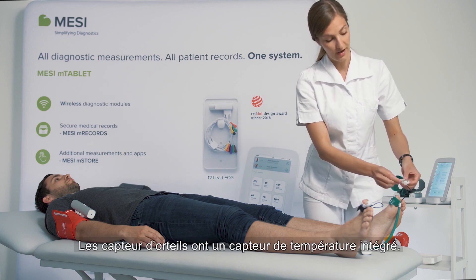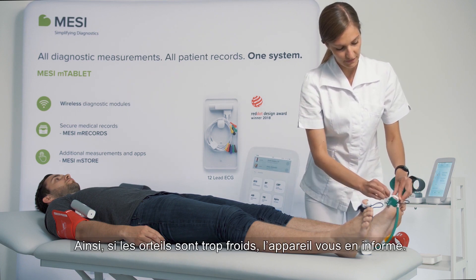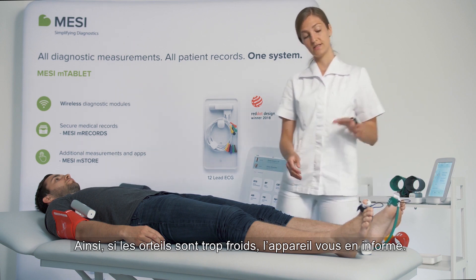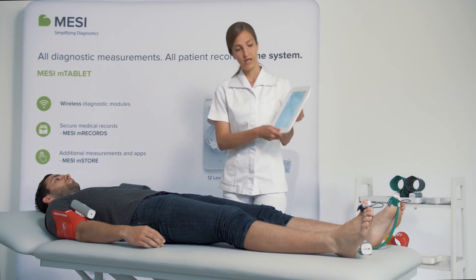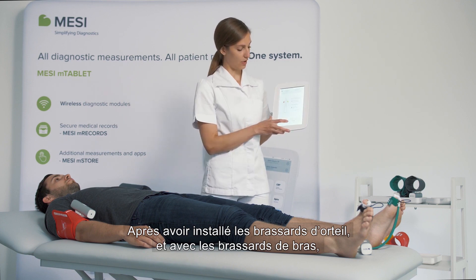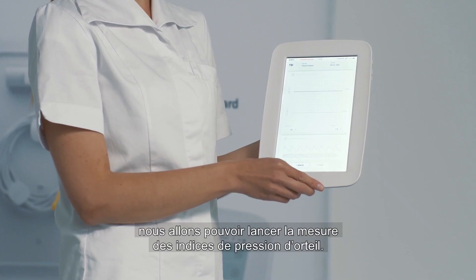The toes also have integrated heat sensors, so if the toes are too cold, the device will let you know. After you have placed the toe cuffs, you still have your arm cuffs from the ABI measurement, and we can continue on to the toe brachial index measurement.